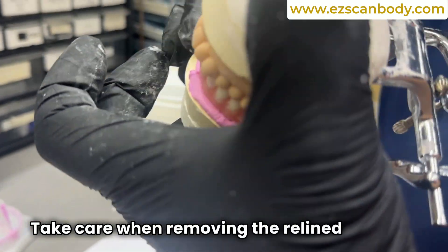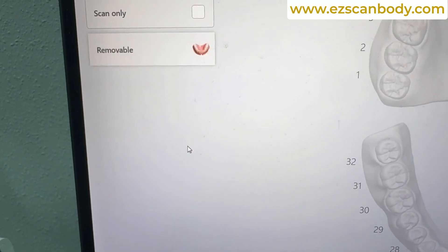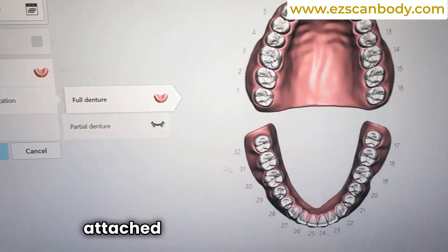Take care when removing the relined denture from the patient's mouth to avoid snagging on stitches. Ensure the impression material remains securely attached to the denture.